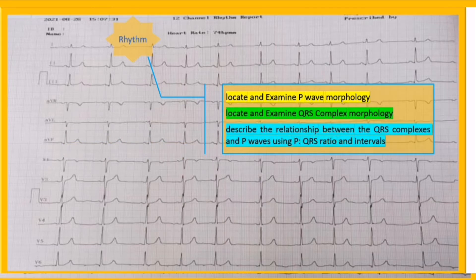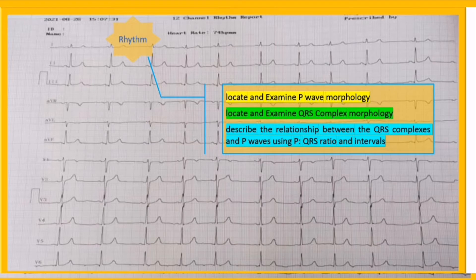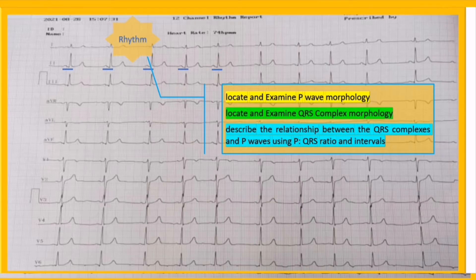Third: describe the relationship between the QRS complexes and P waves using the P:QRS ratio and intervals, including RR interval, PP interval, and PR interval. These are determining factors to discover the actual relationship between QRS complexes and P waves. Here, the P waves are associated with QRS complexes in a one-to-one fashion, and the PR interval is stable.